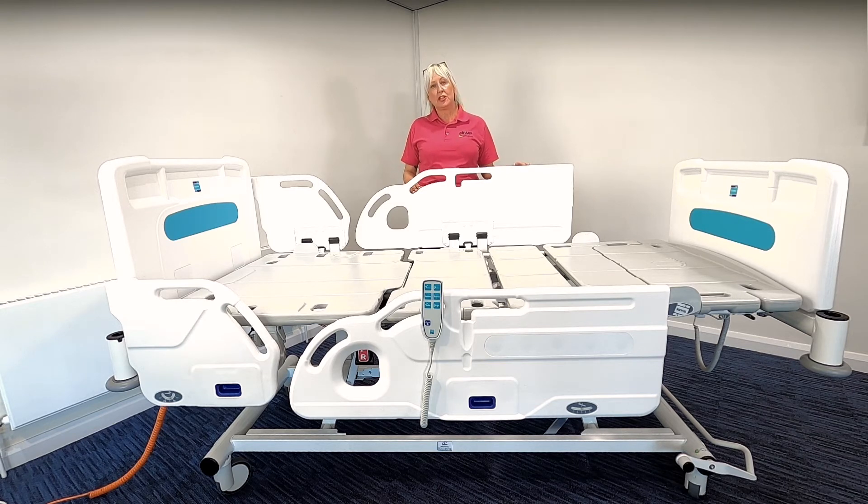The bed is a four-section profiling bed and it can achieve a maximum platform height of 75 centimetres and a minimum platform height of 34 centimetres. The bed has a safe working load of 255 kilograms and a safe patient weight of up to 190 kilograms. This is to take into account any accessories that may be applied to the bed platform.